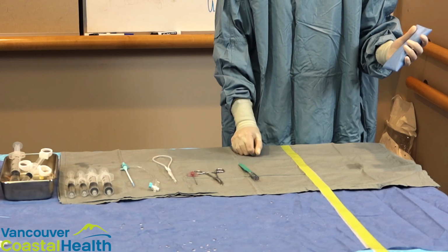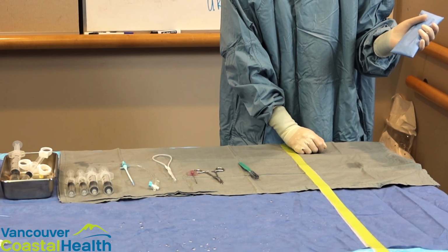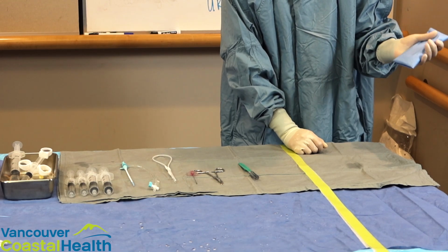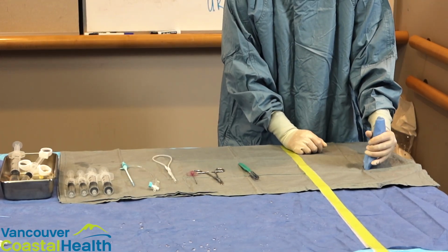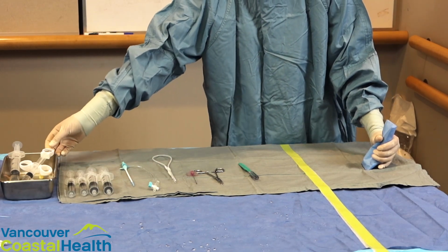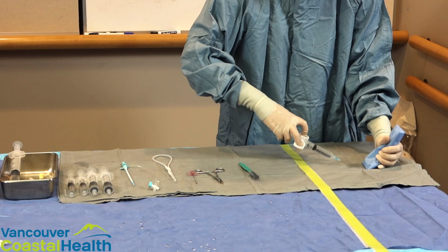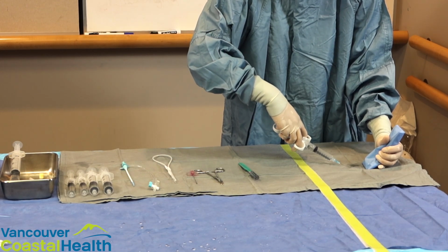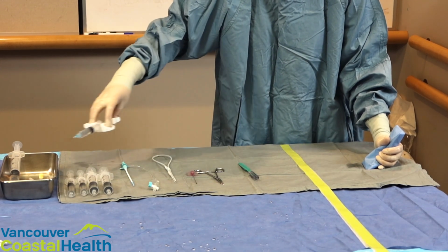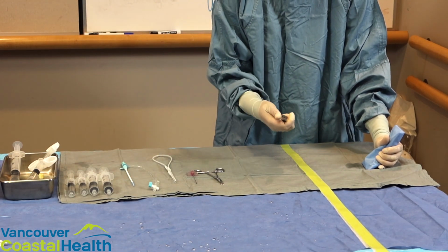So the physician will have an ultrasound probe in their hand. I don't have one, I'm just representing it with an ultrasound probe pack, but they would be ultrasounding and checking for the blood vessel or the structure that they want to get into. And the first thing that they would do once they've targeted their blood vessel is lidocaine. So they would infiltrate the site to numb it, and this is when you need to have your sharps bucket handy for the radiologist so that they can put the sharps directly in.